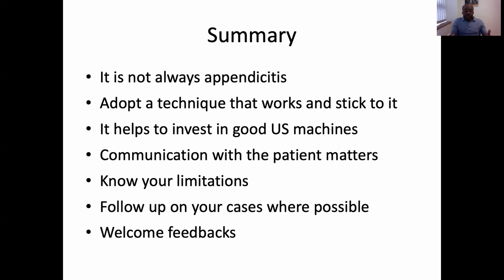Communicate with your patient, very important. Speak to them. Oh, hi. Tell me, so what's been going on with you? So how long have you had this pain for? When did this pain start? Can you show me where this pain is? Can you point at it with one finger, please?